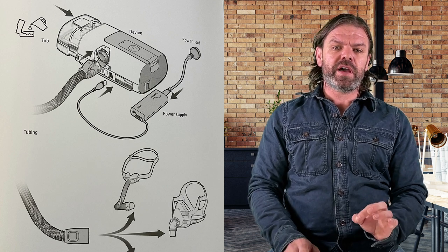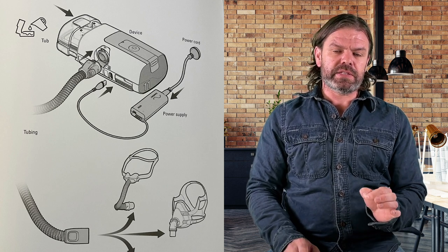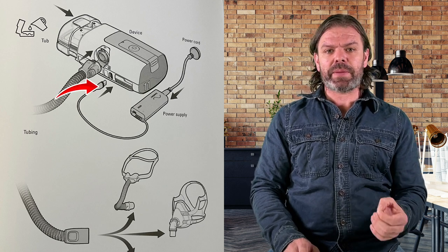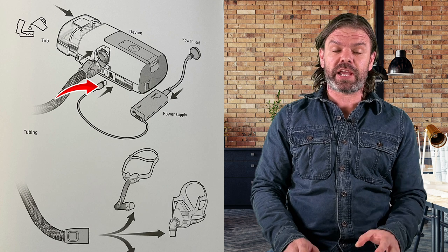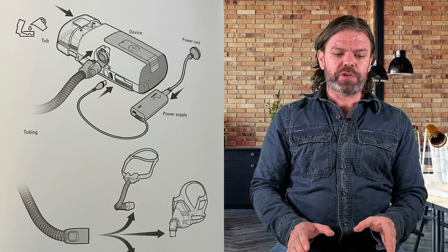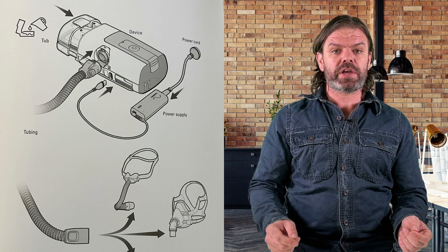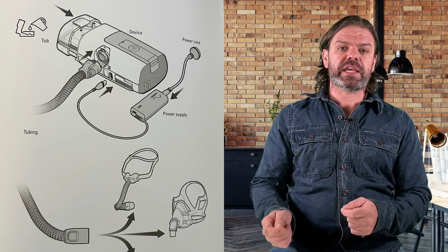Moving on, page two. The only thing I can see different here is the power cord and the connector. It looks like they've gone to the same connector they used with the Air Mini machine. That's going to be a little bit annoying for those of you using the AirSense 10 with batteries, because you're going to have to go hunting around for new DC cables.